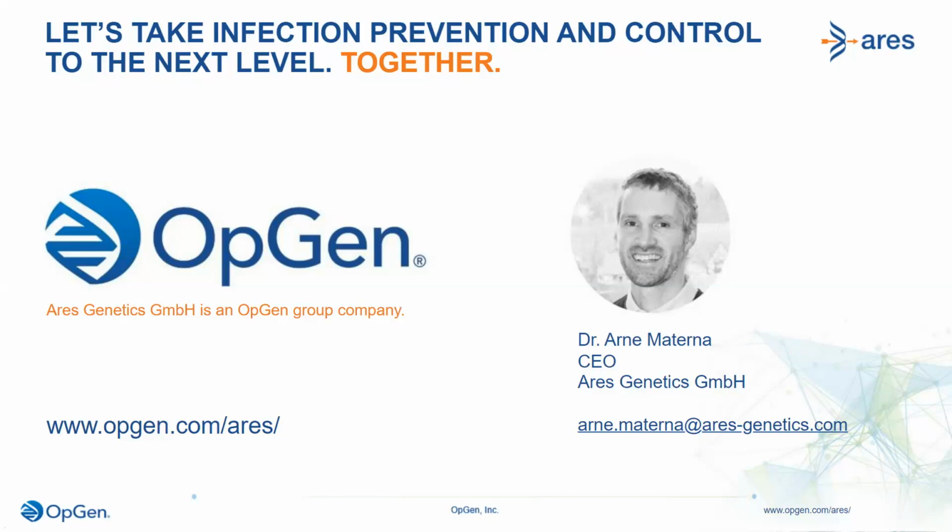Yes. So we are, of course, happy to share studies and protocols and also the reference materials we use for validating our assays. And we have our team on standby to elaborate on these. However, I need to point out that to be compliant with regulations, the actual validations of laboratory developed tests, or LDTs, need to be independently carried out by the clinical or reference lab that is seeking to implement them. And in fact, to lighten that particular burden for labs with independent access to NGS was one of our main motivations for publishing and sharing our validation protocols, as well as results and reference materials. And also for supplying Ares Cloud to enable these labs to independently generate pathogen data with the same level of accuracy and the same reporting and data interpretation features that our service labs in Rockville and in Vienna enjoy.